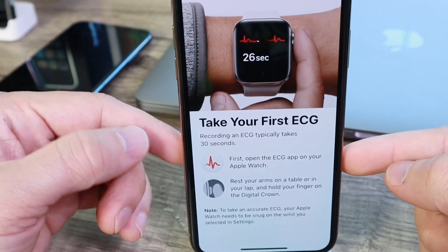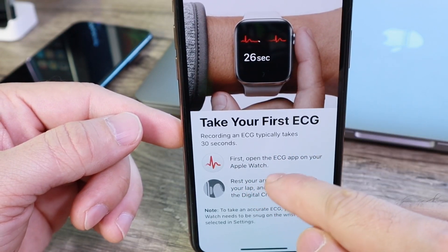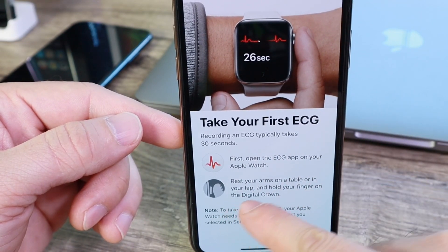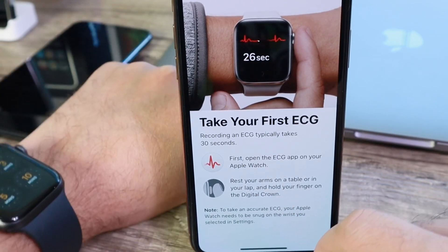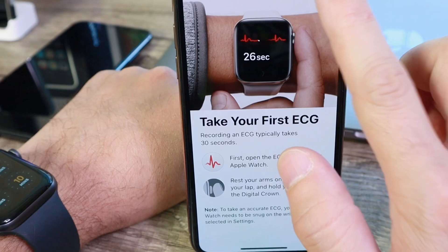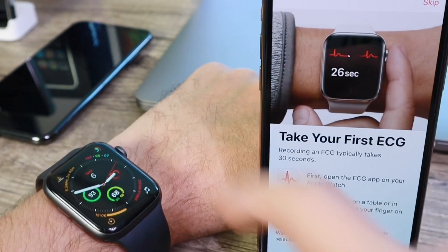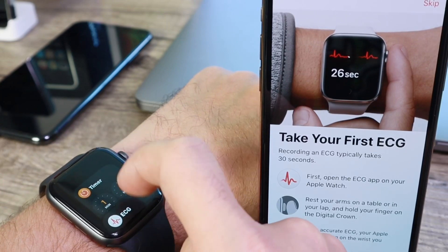Now it's explaining how to take a reading. Recording an ECG typically takes about 30 seconds. First, open the ECG application on Apple Watch, rest your arm on a table, and place your finger on the digital crown. Let's go ahead and launch the ECG application on Apple Watch and start the process.